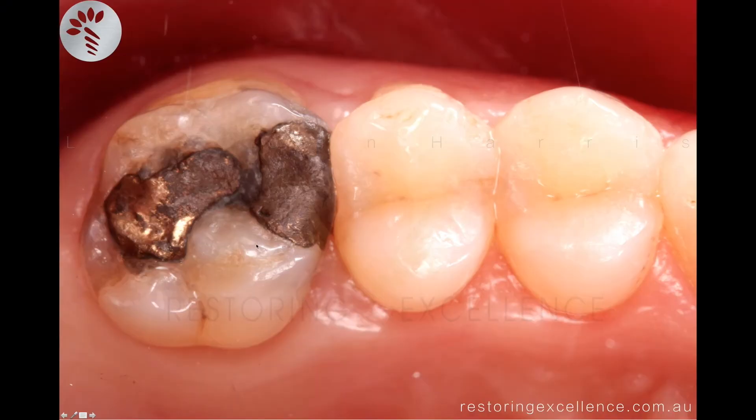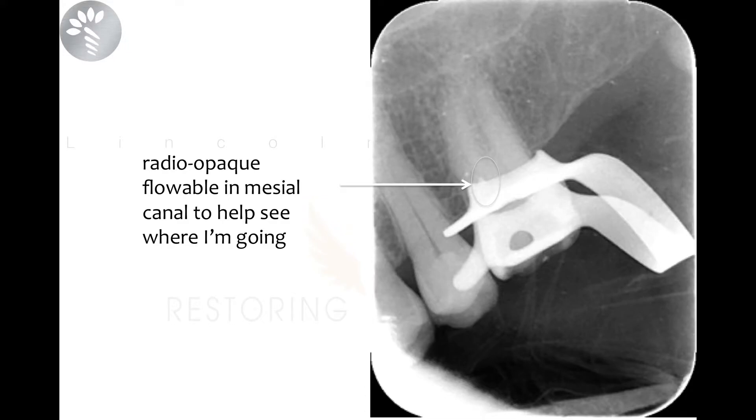This patient presented with a strange pain — like a cracked cusp toothache, with sharp pain on biting and sensitivity to cold. We tried doing a cusp capping restoration and that didn't work, so it seemed like irreversible pulpitis, and we decided to go in and do endo.